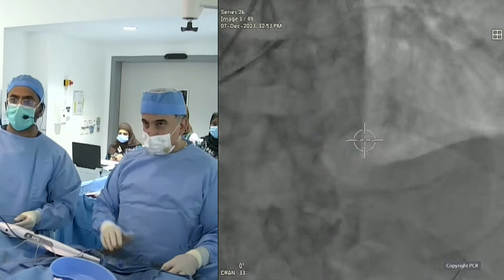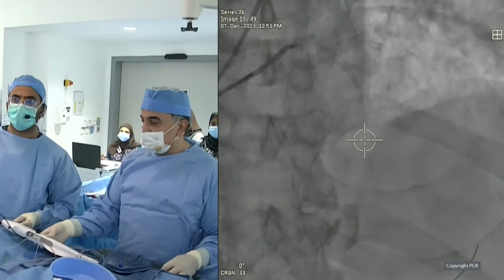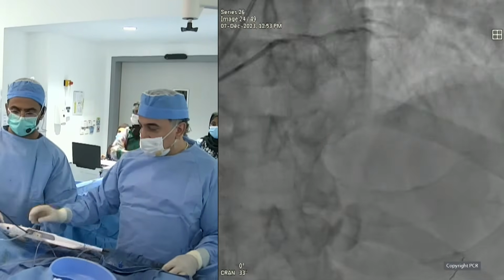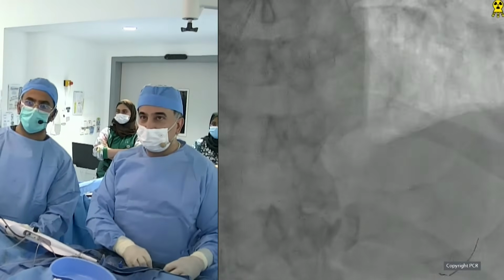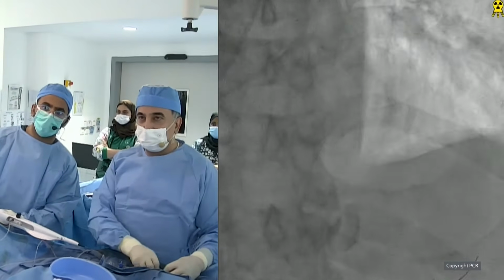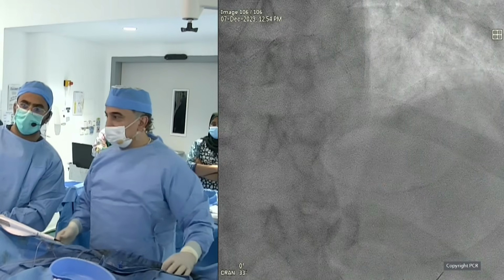No, go ahead. We already finished the rota. So we know that plaque is in the lateral wall opposite to the carina. And you see the tightest point here is exactly at the bifurcation level, exactly where the balloon stopped. I don't know if you can see it here. Can we get the whiteboard up, the smart screen?